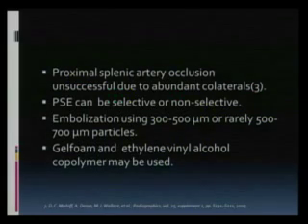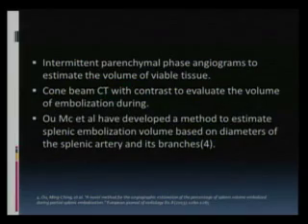Looks very fancy. The problem with that is you need a triaxial system, you need to get a sheath there, so there is a lot of equipment cost, and then glue is very expensive. It's a couple of thousand dollars. So for something you can do cheaply, they do it the expensive way, but it's done.